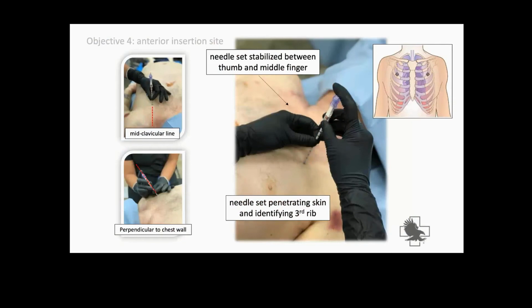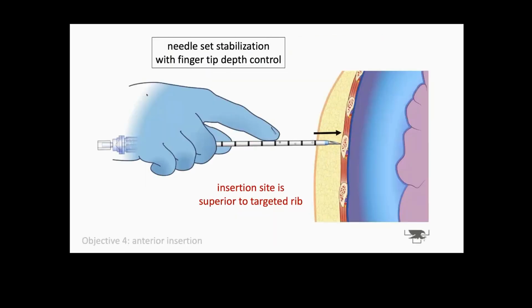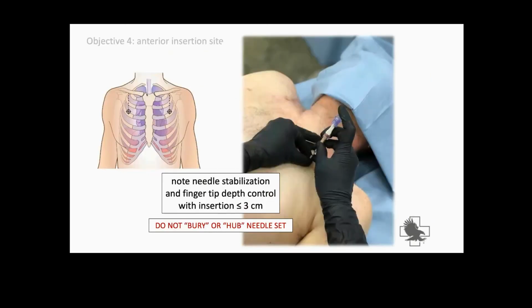So with that said, they're showing here that once again, we went from kind of controlling the needle at the tip to changing to more of a penciled formation. And as you're going in, you will be coming down probably right on top of the rib. We don't need to stab the rib aggressively. We don't need to push on the rib very hard, but you do want to kind of come down on top of that rib at first with a plan to go over that rib and come over the cephalad orientation of that rib, coming over the top of the rib.